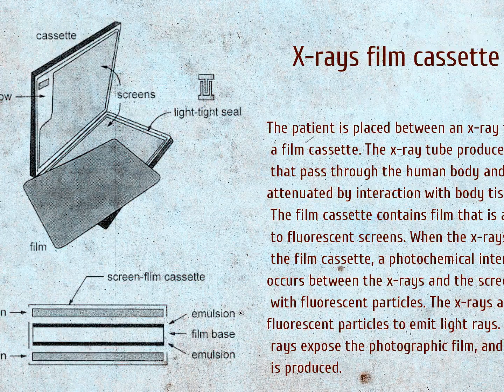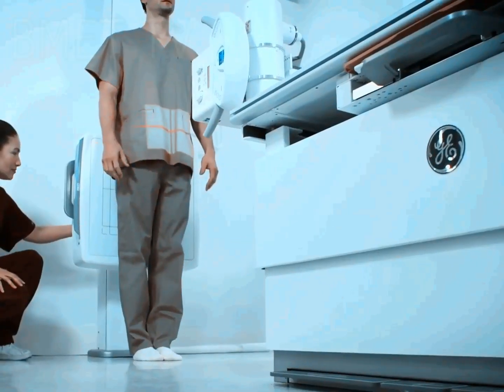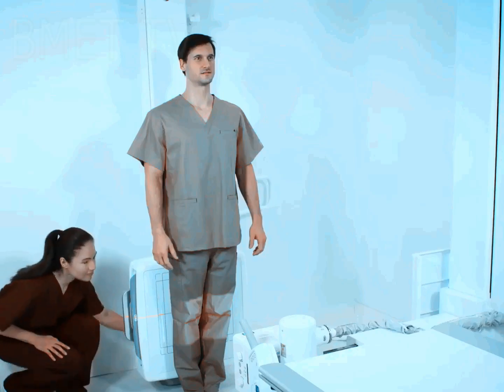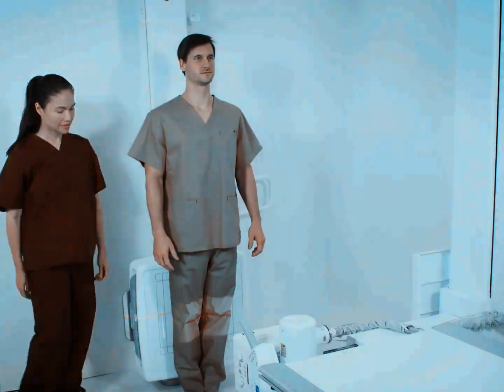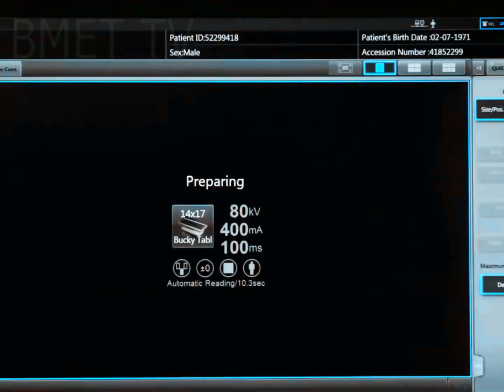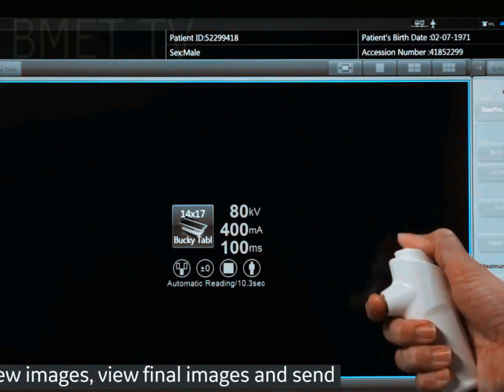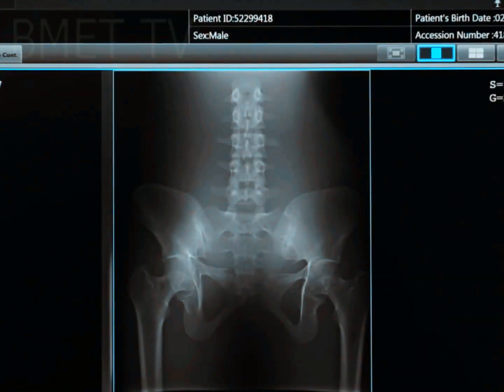The frame constitutes a shallow container into which can be placed a thin intensifying screen and film. The back of the cassette is constructed from a strong metal. It is customary to spray the internal surface of the back of the cassette with lead paint, the purpose of which is to absorb secondary radiation scattered back onto the film, called backscatter. The back of the cassette contains a felt pad. The intensifying screen at the back of the film lies on this felt and is usually glued to it. The function of the felt is to maintain this screen, the film, and its fellow screen in uniform, firm contact.